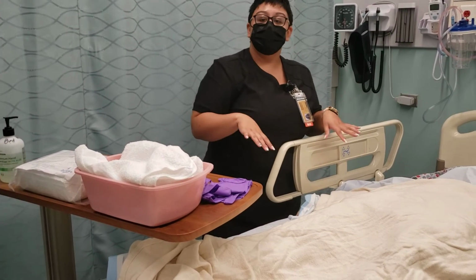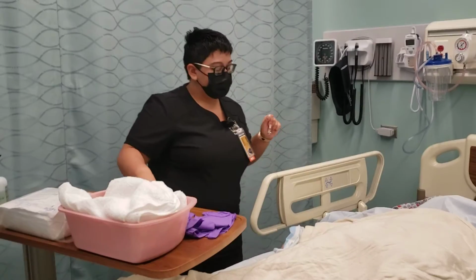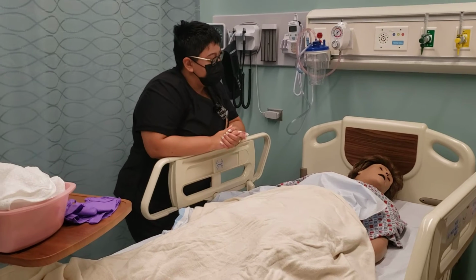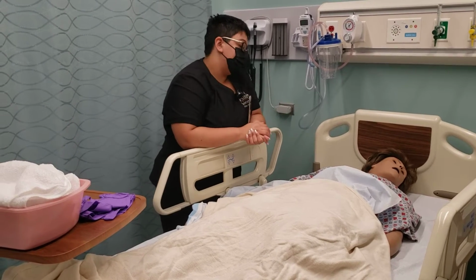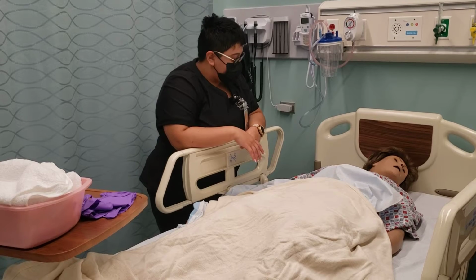And now I'm going to enter my patient's room, introduce myself, explain the procedure, and get everything together. So, good morning, Mr. Williams. My name is Jazzie. I'm a P&W nursing student. I'm going to be placing an indwelling Foley catheter. It's just a small tube that goes in through your urethra and into your bladder, and it's going to help drain some of that urine that's there and relieve some of the abdominal pressure that you're feeling, okay?